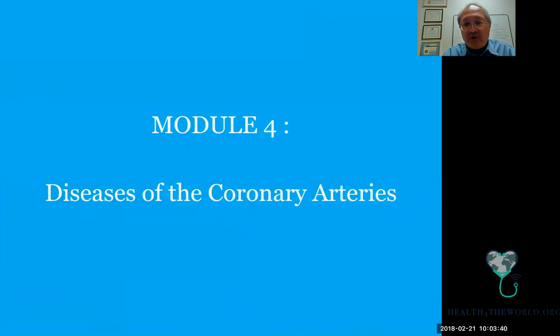Now, in our next module, we're going to turn our attention to look at diseases of the coronary arteries. I must admit, because of the way this lecture is set up, we actually have missed a big gap. There are a lot of vascular structures, as shown in one, for pulmonary embolism. There's certainly a lot of pathology in the chest that involves the aorta, the vena cava, the pulmonary veins, and so forth. But because we're going to turn our attention toward a relatively unique aspect of CT and what we can do today with cardiac synchronization, we're going to dedicate modules to look at disease of the coronary arteries, and highlight what CT can do for us today.